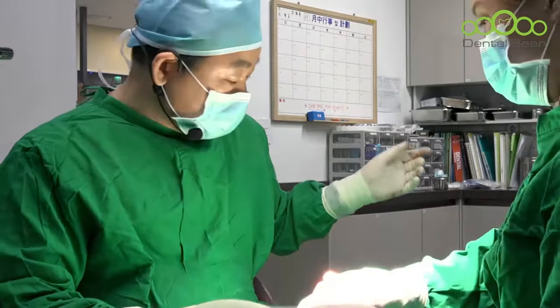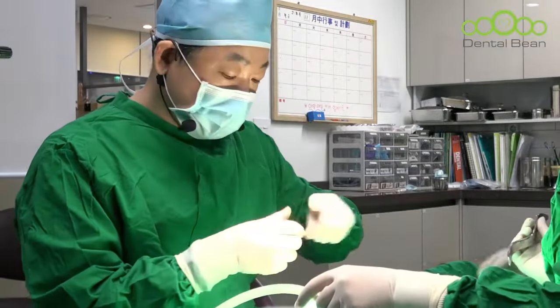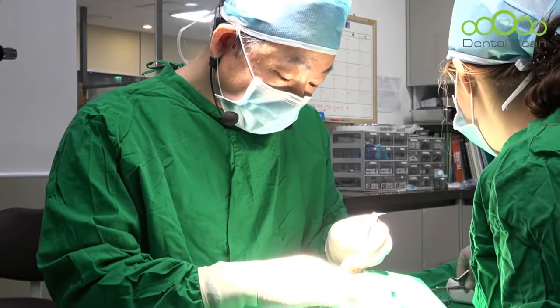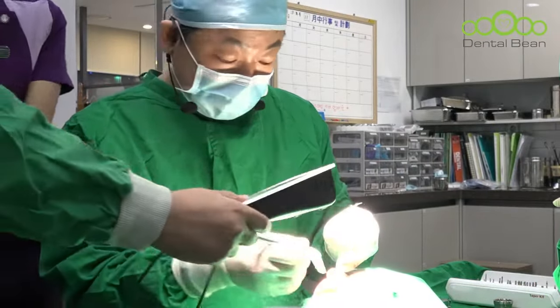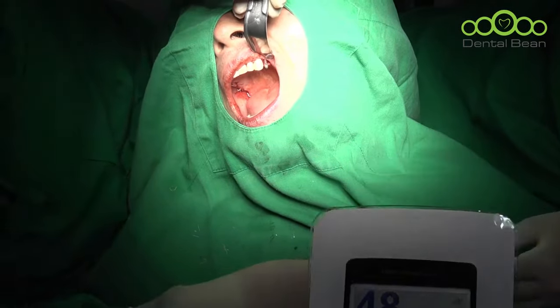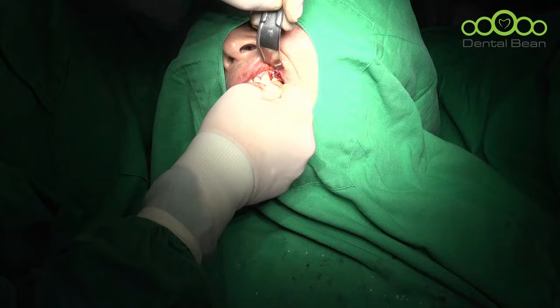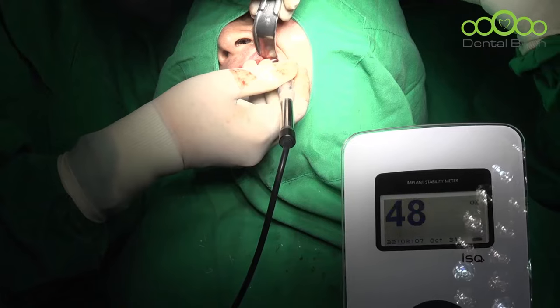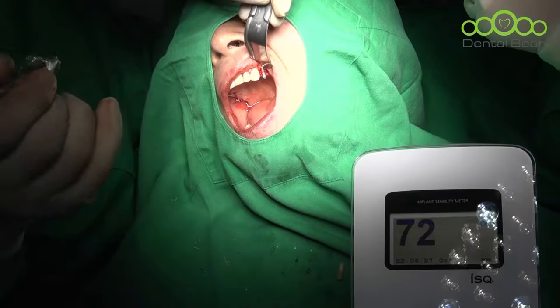Cover screw. Hold on. I ask you. I omitted something. Let's check implant stability. I found that the left implant looks stronger than the right side. Let me check. Okay. Hold on. I didn't connect it well. Sometimes misconnection leads to poor stability. Seventy-two. Okay.